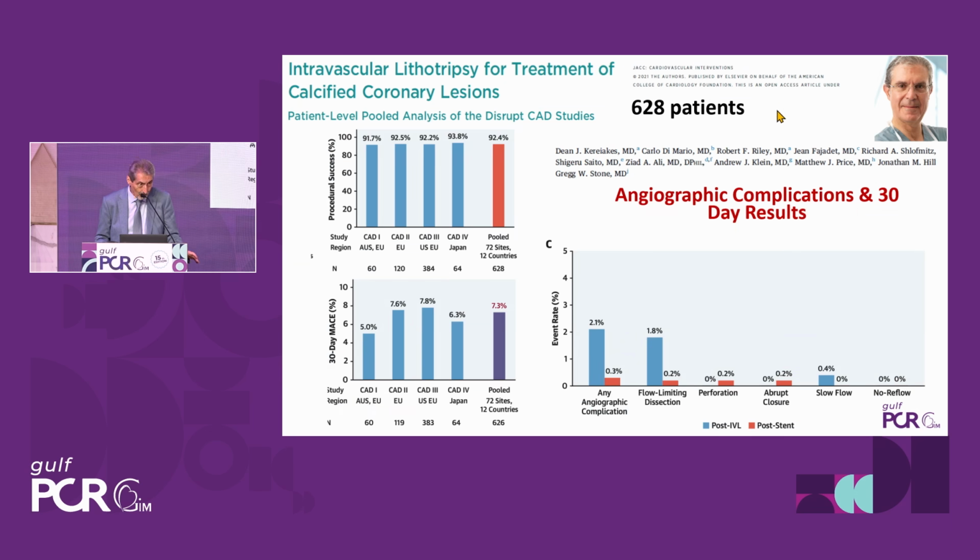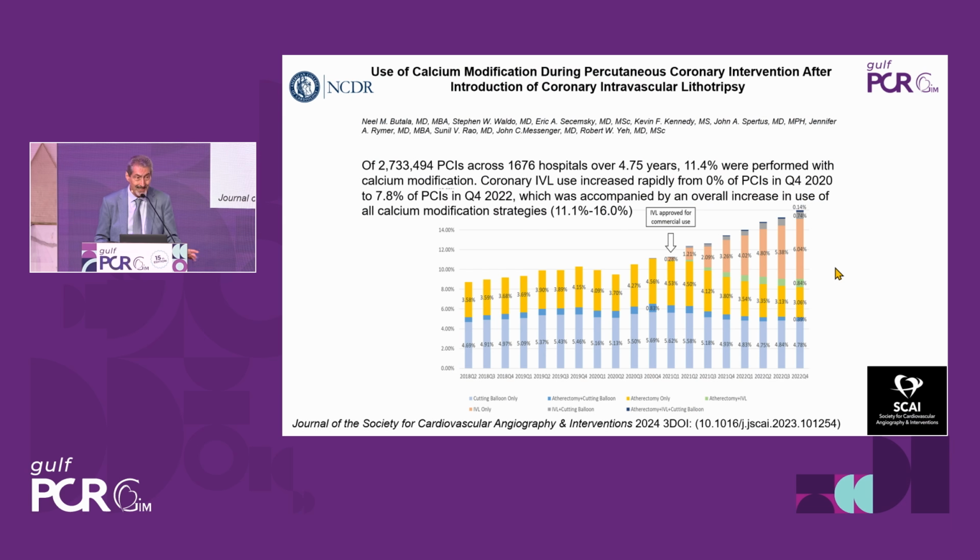I mean, we are all aware of how well documented is the extreme safety of intravascular lithotripsy in truly complex lesions like the ones enrolled in the DISRUPT trial and this large meta-analysis presented by Dean Kyriakis a few years ago, with 0 perforation induced by the lithotripsy balloon, very few overall, and very low numbers of angiographic complications or flow limiting dissections.